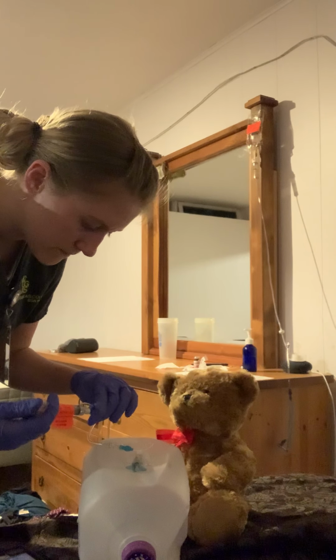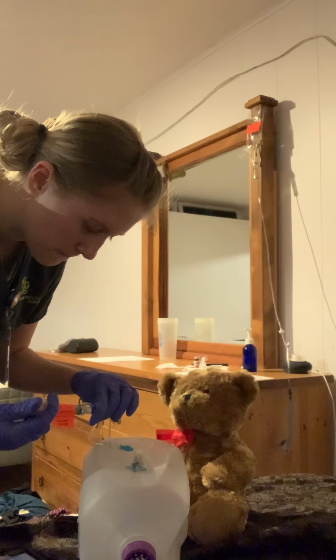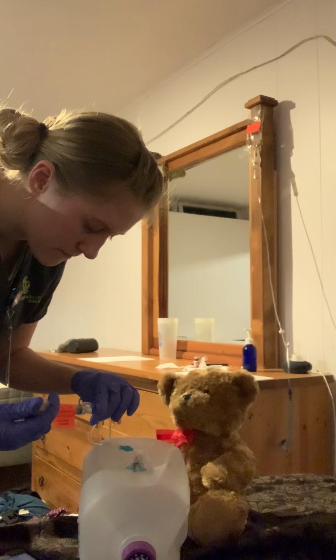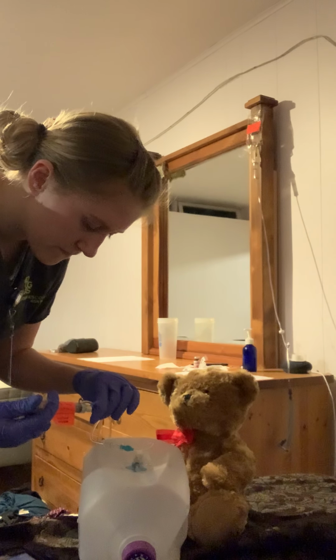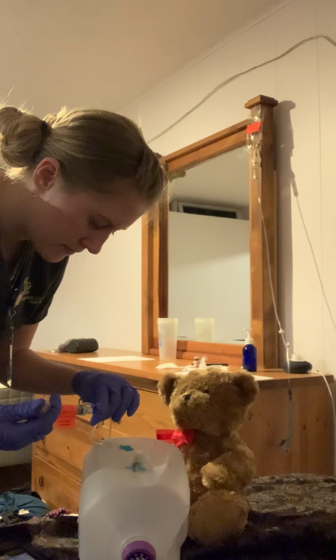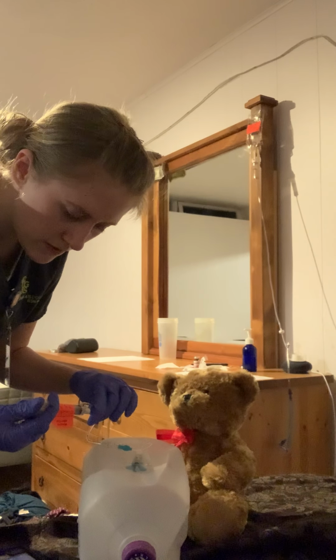Okay. Okay, 30 seconds, another 2 mils. Go down. Okay, and then stop again.